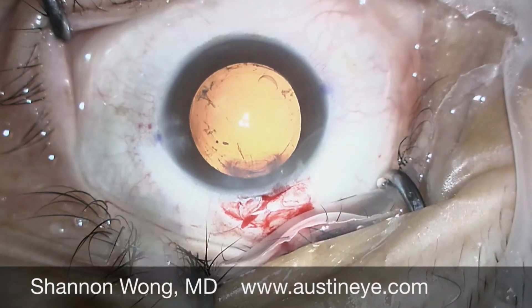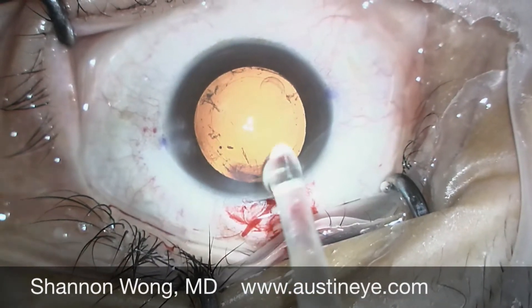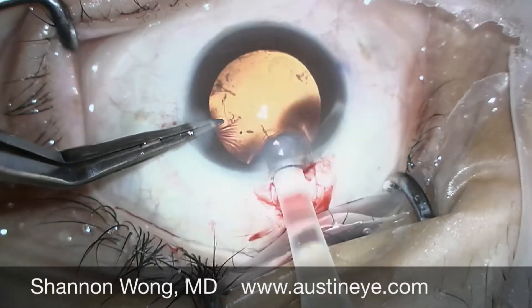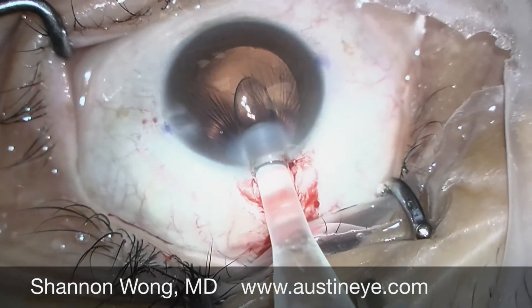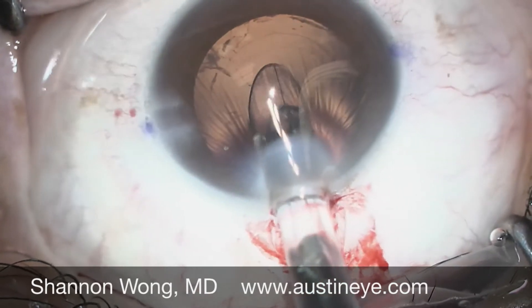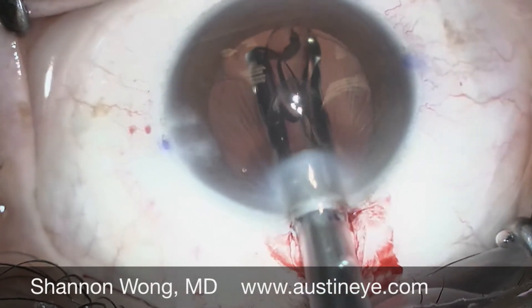We insert it into the platinum insertion device and we begin to deliver the lens into the capsular bag. The leading haptic goes in nicely.